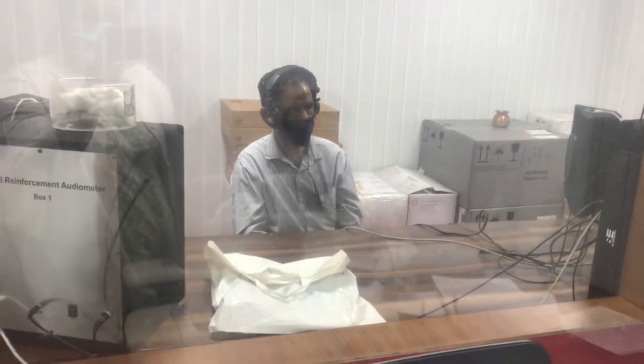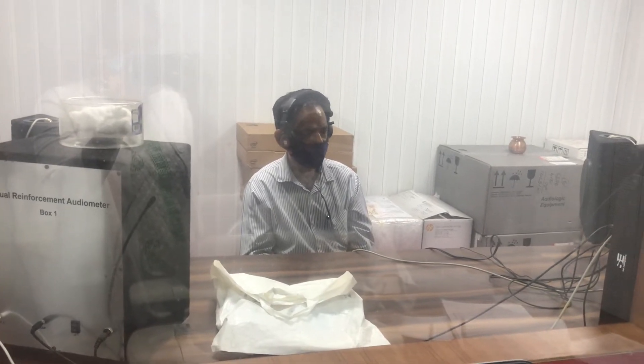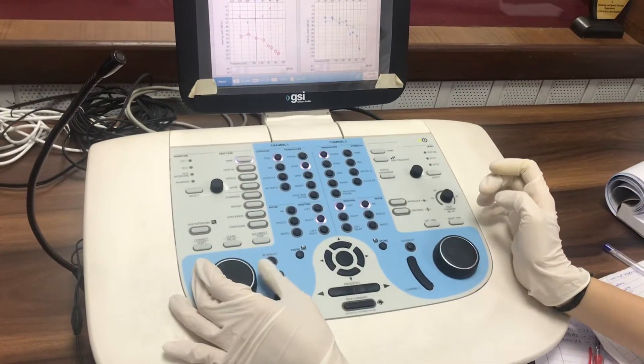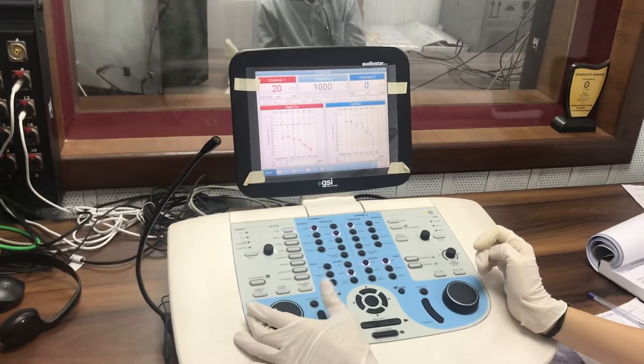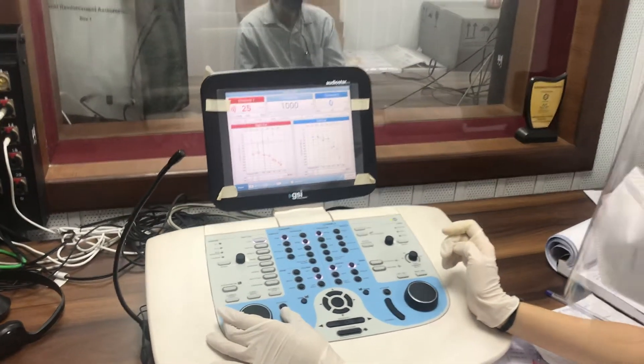This is the placement for BC masking. We would be masking the left ear, so the headphone is placed on the left ear, and the right ear headphone has been unoccluded. The BC vibrator is placed on the right ear. On the channel selection, you would change to channel 2 for noise, and you will present the BC input through the right ear, while the left ear will receive noise for BC masking.